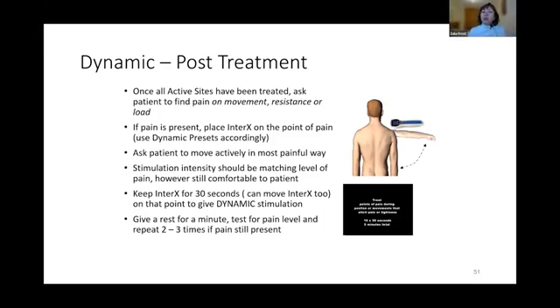What you could do, you connect with the brain dynamically. So either put on stretch that wrist and put the InterX device right there, yes, still on 90 to 360 or 15 to 60, variables. And then you just hold it like this for 30 seconds, or you slightly rub it like this.